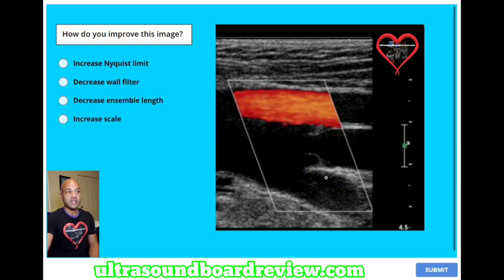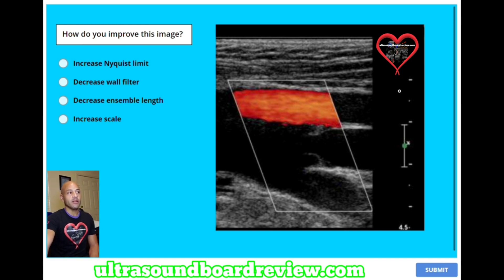As you can see, this image doesn't have any color Doppler down here, but there's color Doppler right there. So how do we fill in this color Doppler down here? What's going on? How do we fix this image?